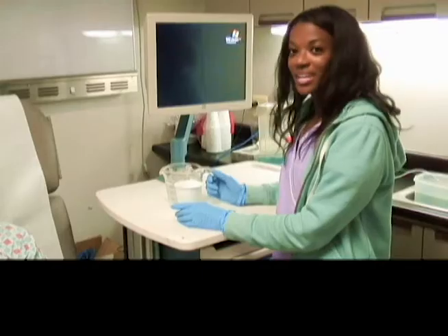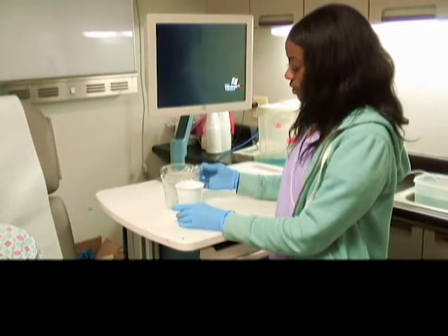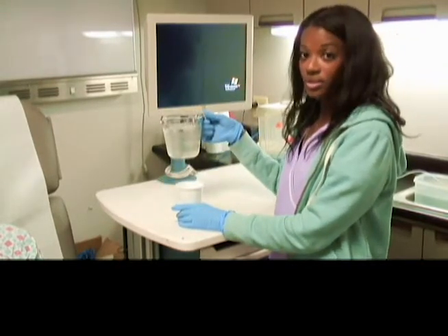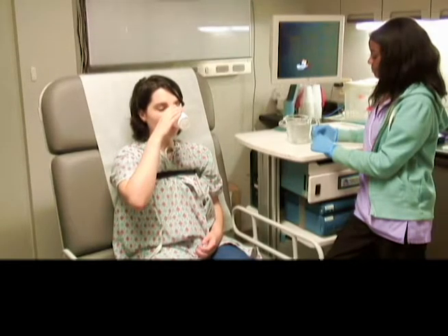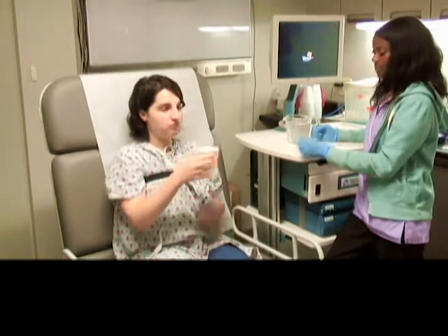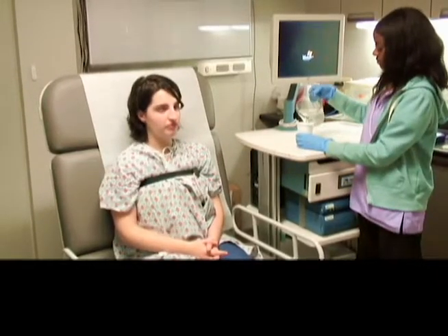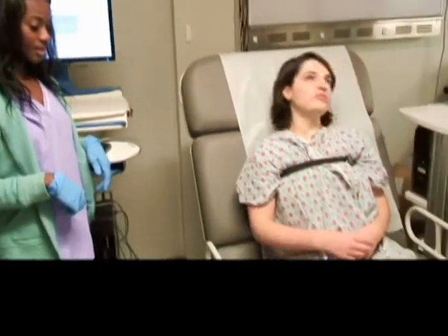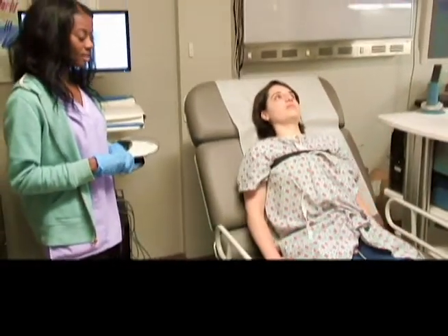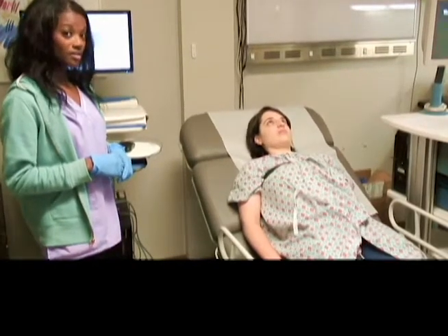Next, we're going to have the patient drink water. She's going to fill up until she feels full. And we are going to measure the amount of water she drinks with a measuring cup. So the patient is just drinking room temperature water steadily until she feels full. We're going to put Emily back down. And she's going to get back in position with her hands at her sides, legs uncrossed. And we're going to begin the study.